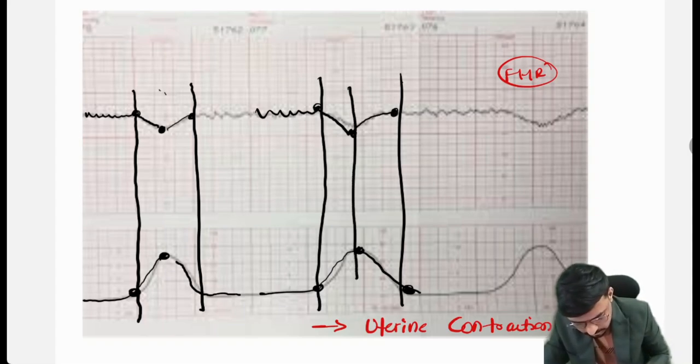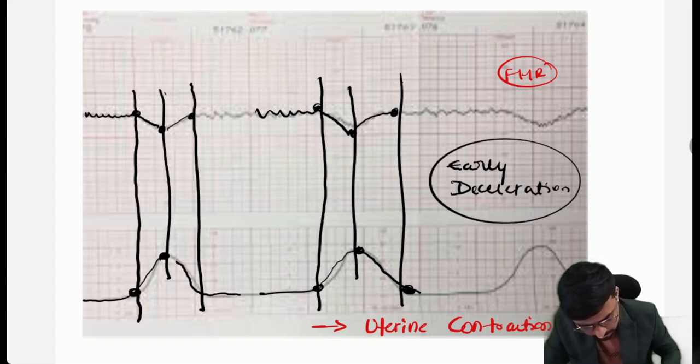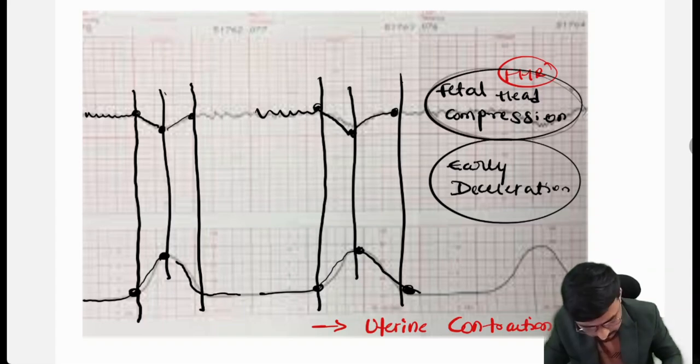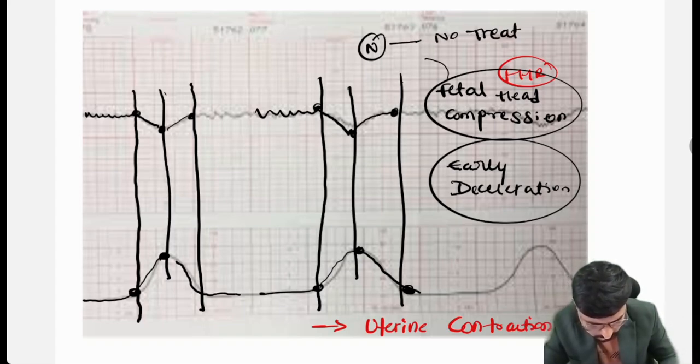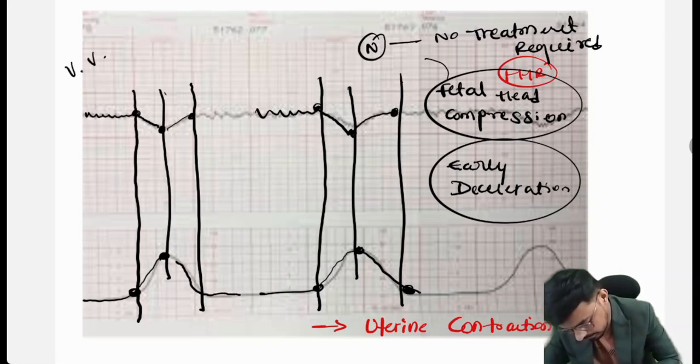This mirror image will be seen in case of early deceleration, which happens due to fetal head compression. It is clearly normal and no treatment is required. These are the points you have to keep in your mind. Hope it is clear. So this is a very, very important image based question.